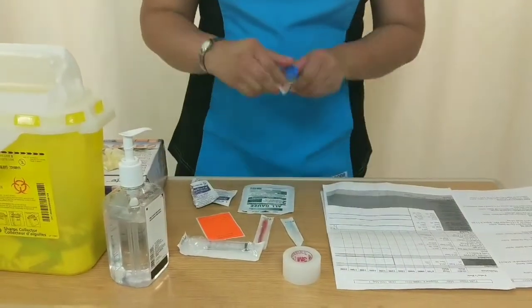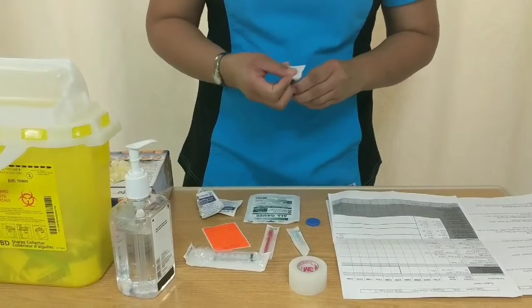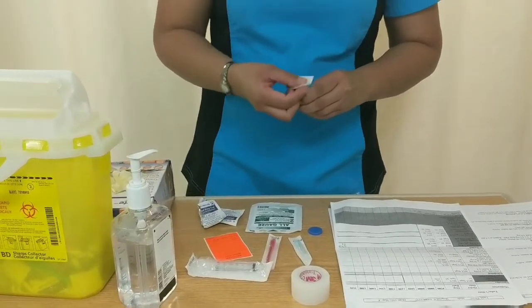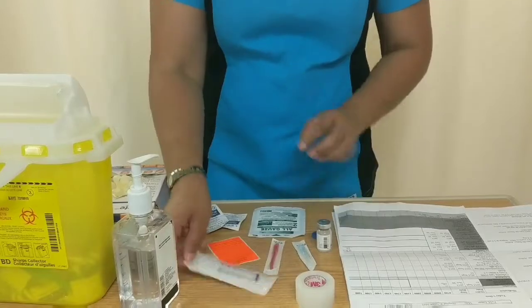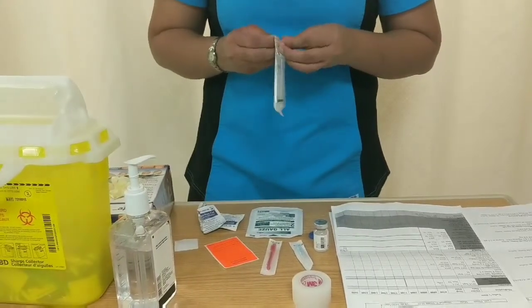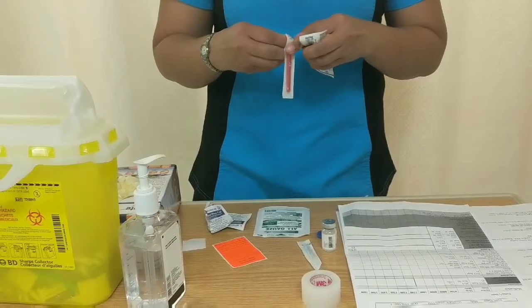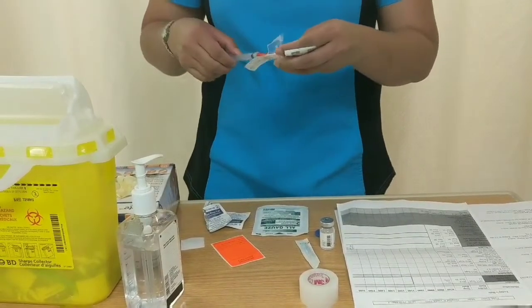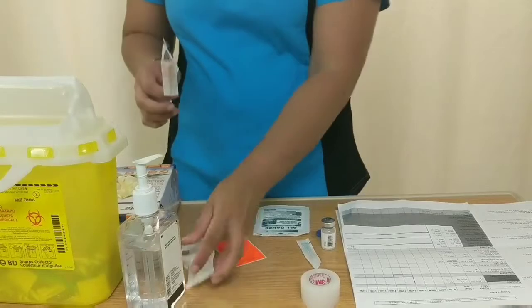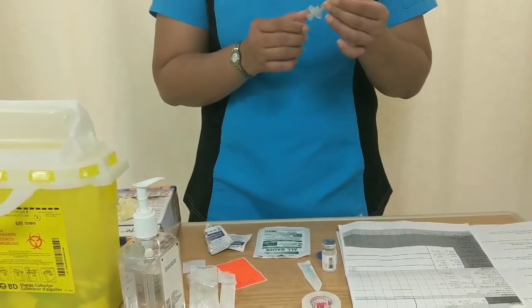Clean the vial with alcohol wipes for 30 seconds in a circular motion. Connect the syringe to the blunt needle and inject air into the vial, the same amount as the medication volume that you are going to aspirate.